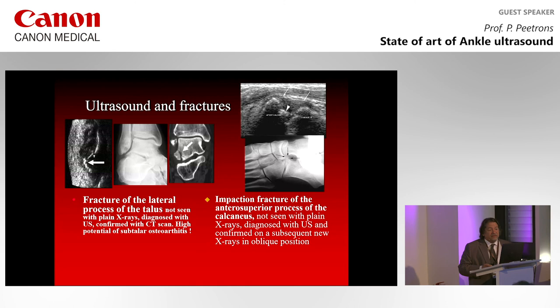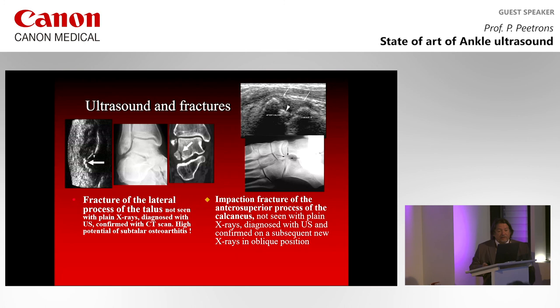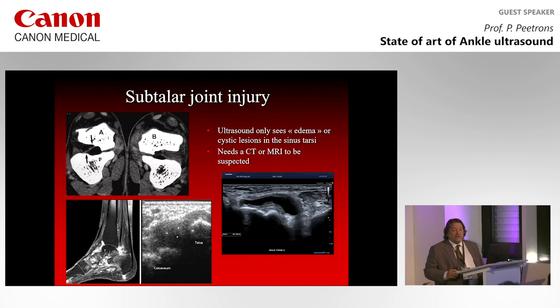Or I see the fracture of the anterior superior process of the calcaneus, which is very, very difficult to see in X-rays, as you know. So this is very important. We are in front of the patient. We have to discuss with the patient.